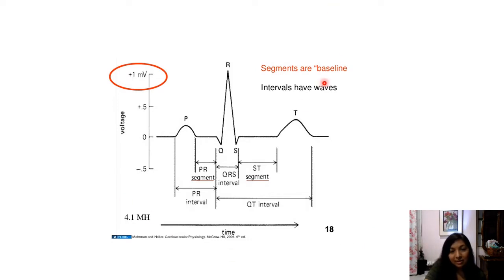Okay, so this is the ECG wave that you should be pretty familiar with by now, but just to recap, you start off with the isoelectric line before any depolarization takes place. Right here is where your SA node depolarizes, and then as that spreads over your atrial muscle, you get your P wave, and so that's your P wave. And then you have that depolarization going to spread down to the ventricle. So in that point, while it's spreading down via your AV node, you have your PR segment.